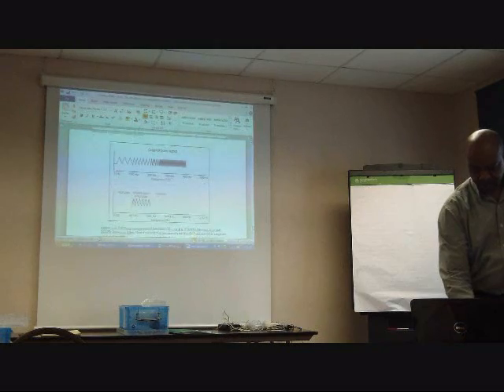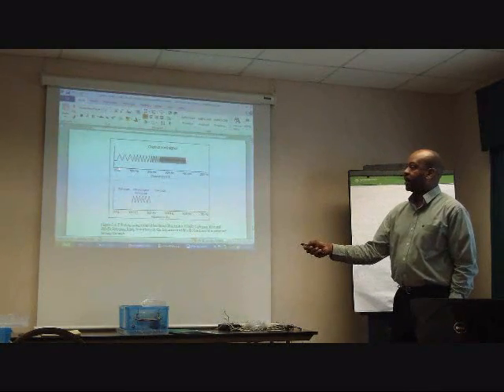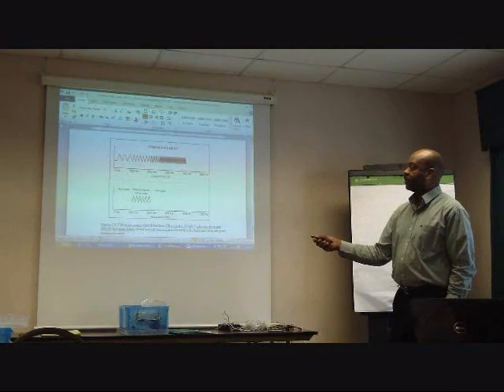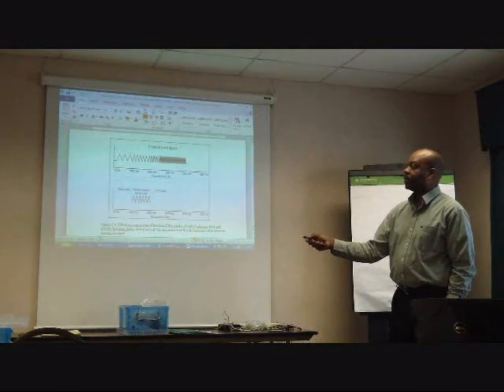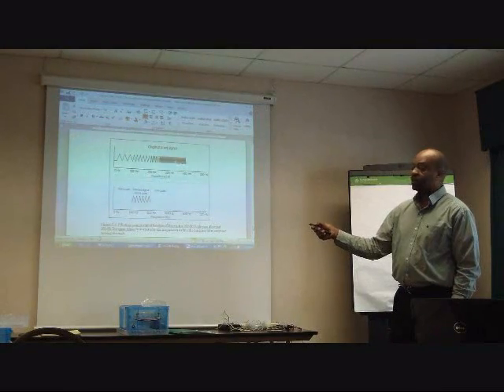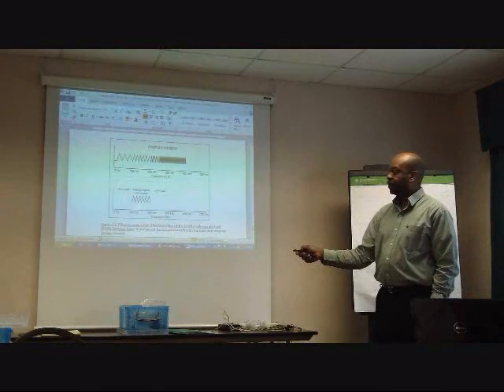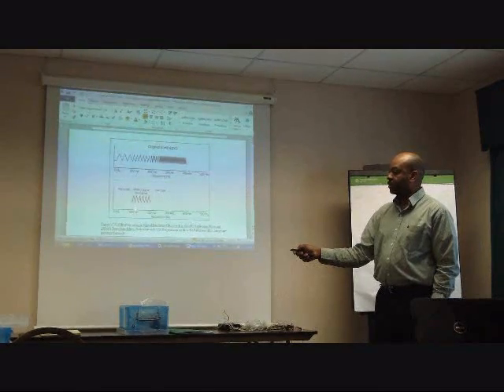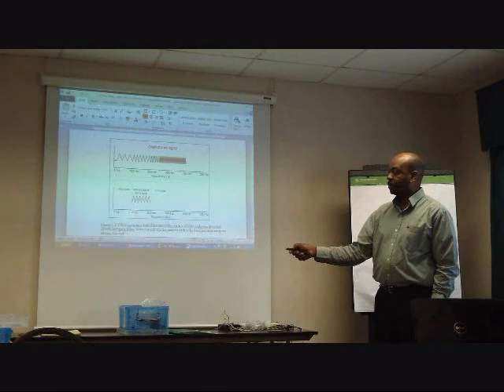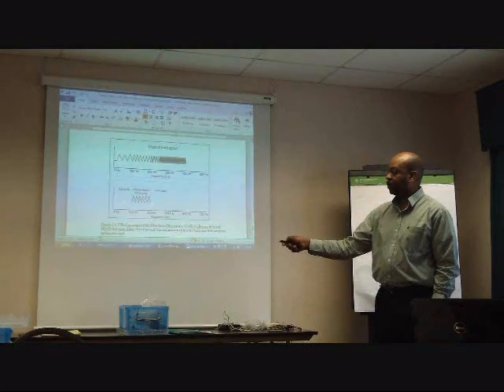Okay, so this is showing the frequency range, like what I was talking about. So you have 0 hertz to 500 hertz. The lower frequencies are fewer cycles per second, and the higher frequencies are more cycles per second. So in the example that I used, if we do a narrow filter, we're looking at 100 to 200 hertz. So we're ignoring all of this, and we're ignoring all of that. And this is what we would get.